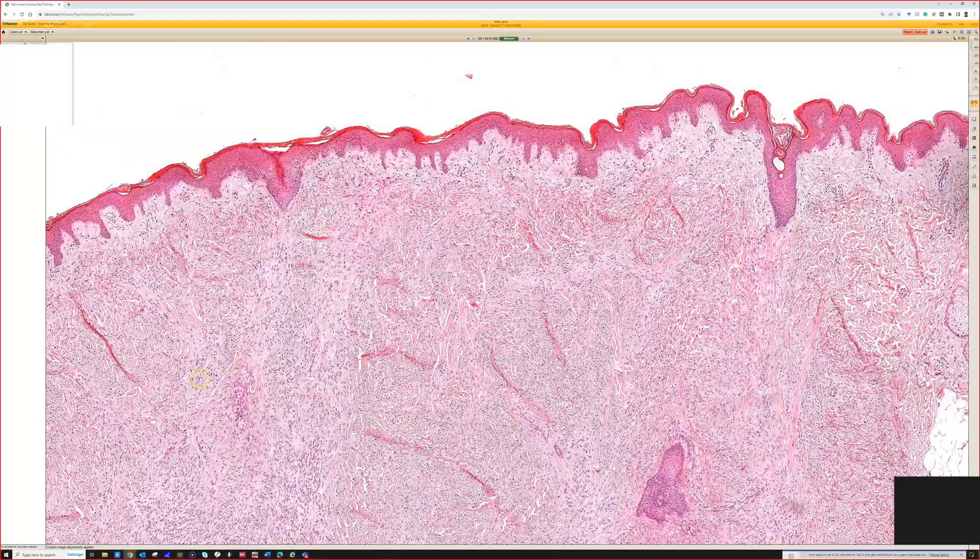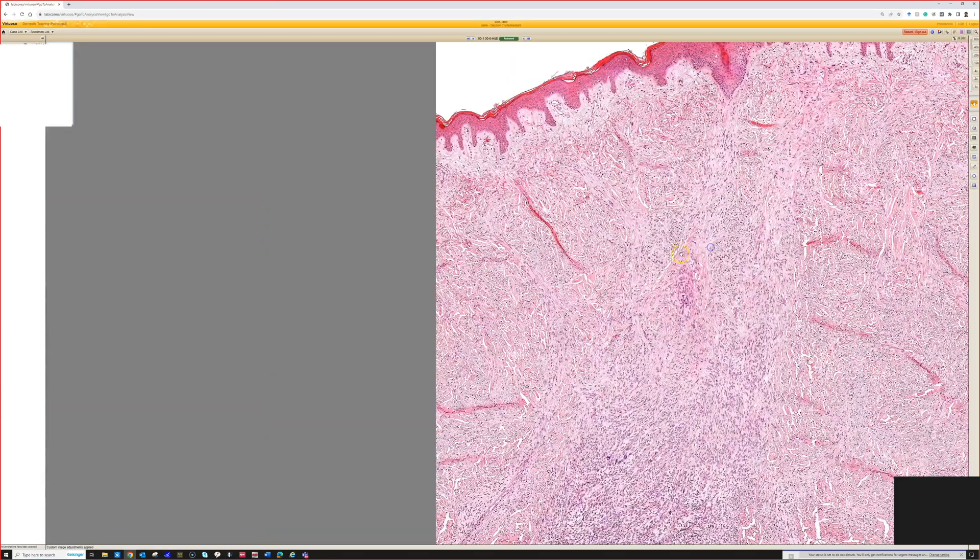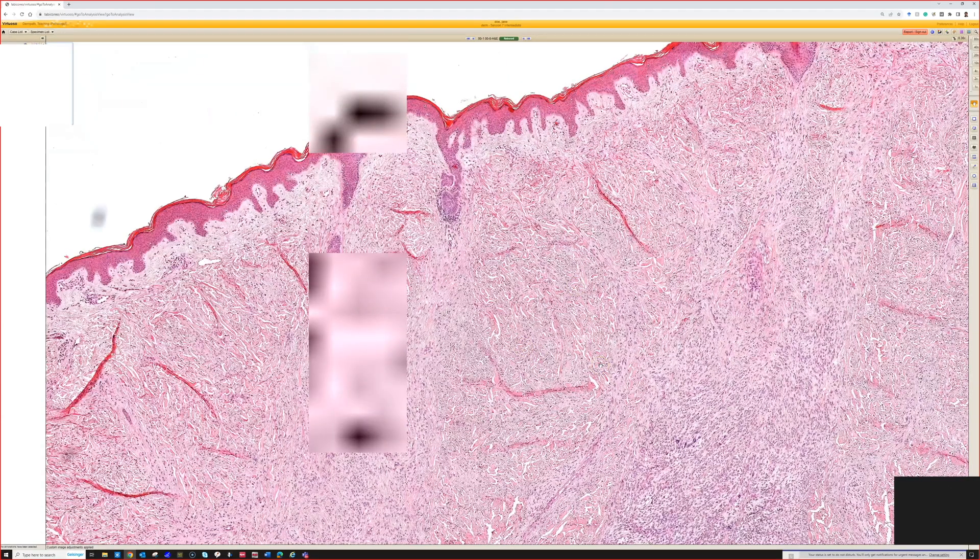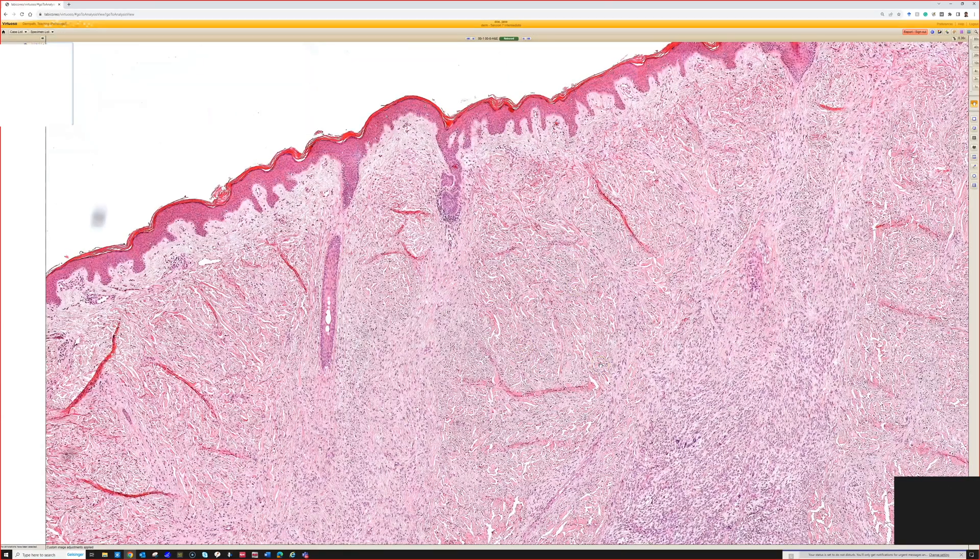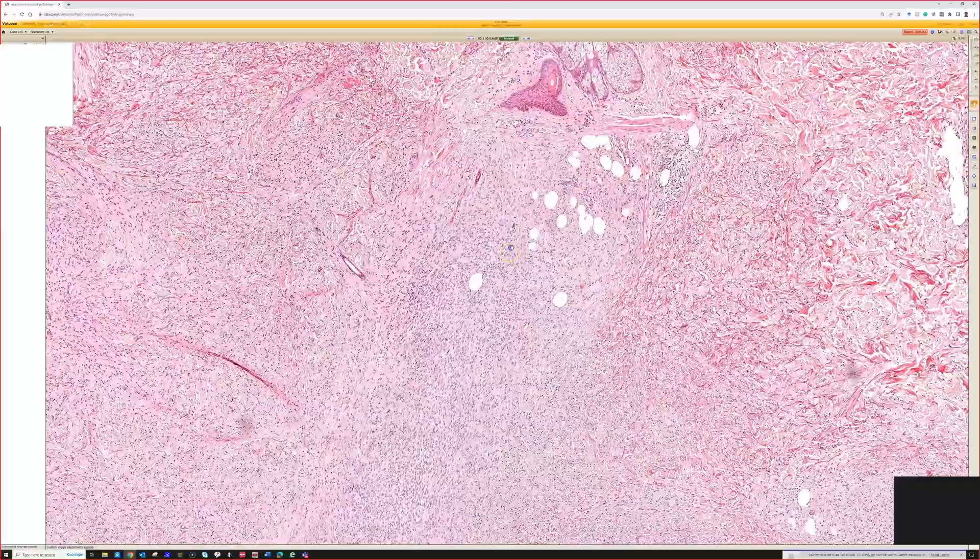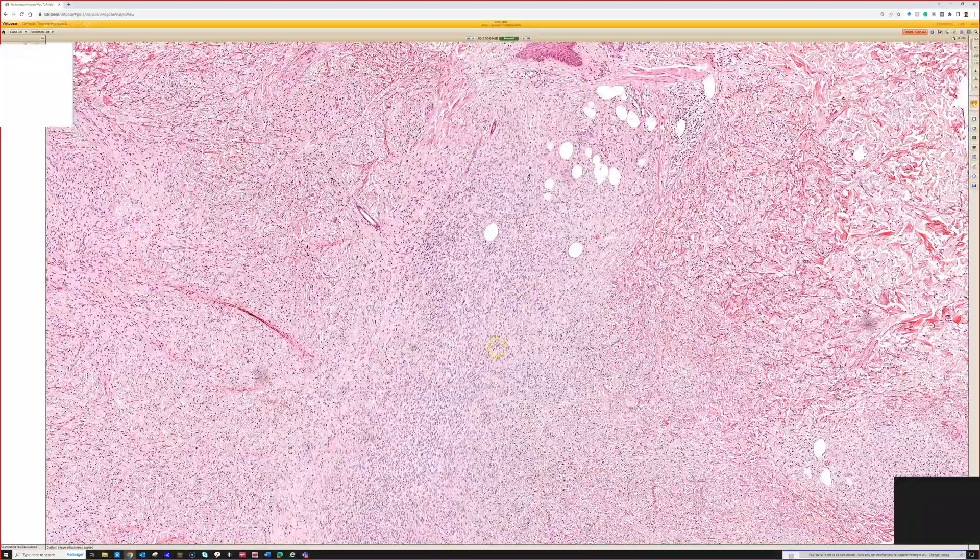This case is not cooperating quite as much as usual, but I find that usually helpful—cellular blue nevus, if you go up to the top and out to the periphery, you'll usually find areas resembling a regular blue nevus. As long as they don't have any really atypical features, they are benign. People often do try to completely excise them mainly because if you do a shave, you probably transected it and you won't see most of the lesion.